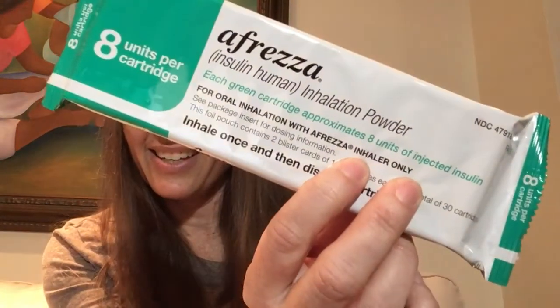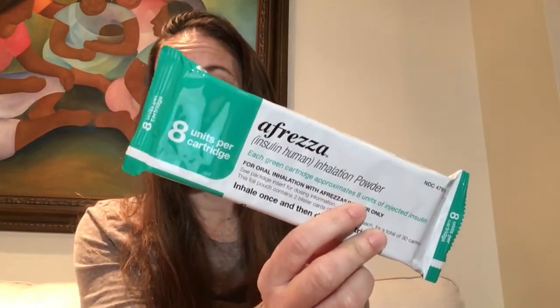Then I went on to the Afrezza package because I mentioned it to him. I said, I think it's 1 to 1. And he said, no, it really isn't. But I'm like, you know what? I saw it in the literature somewhere that it was 1 to 1. He said, nope, you didn't see that anywhere. And then I pulled out one of my foil packs one day, and there on the front it says, each green cartridge approximates 8 units of injected insulin. So 8 units per cartridge, 8 units of injectable insulin. So that's a 1-to-1 ratio.